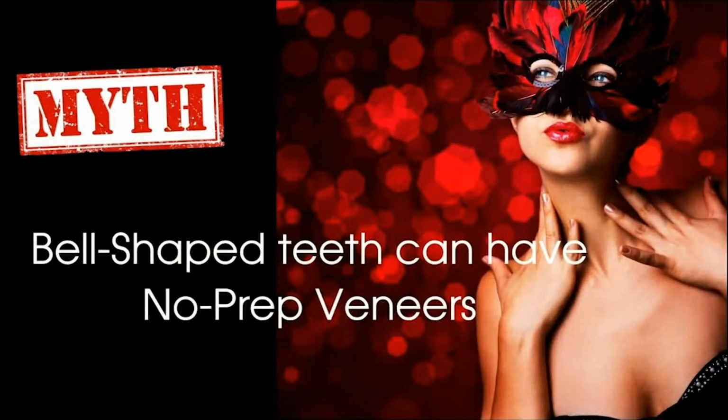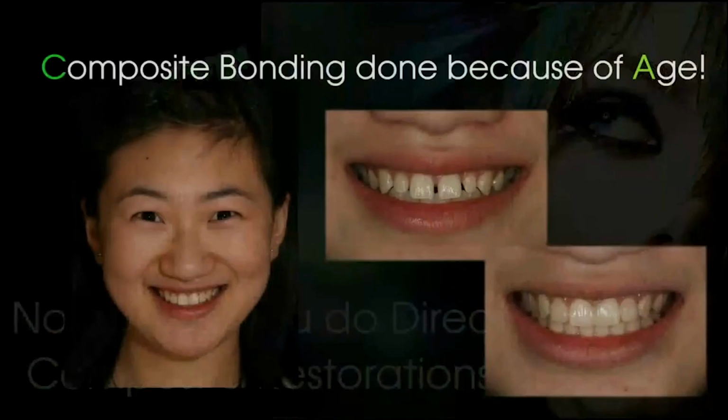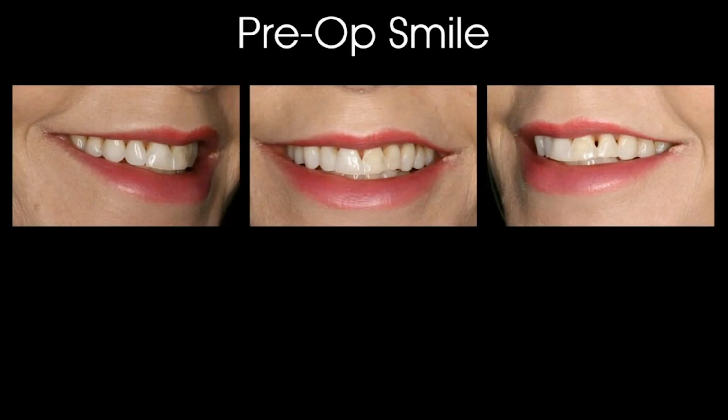This is a good case to learn from because of their bell-shaped teeth. Can they have no-prep veneers? No. Unless you do direct composite restorations, you can't put prepless veneers over bell-shaped teeth. I mean, here's a case I did of composite bonding to close gaps because of age, but there's no way I could have slipped a veneer over something that's wider at the incisal than the cervical.